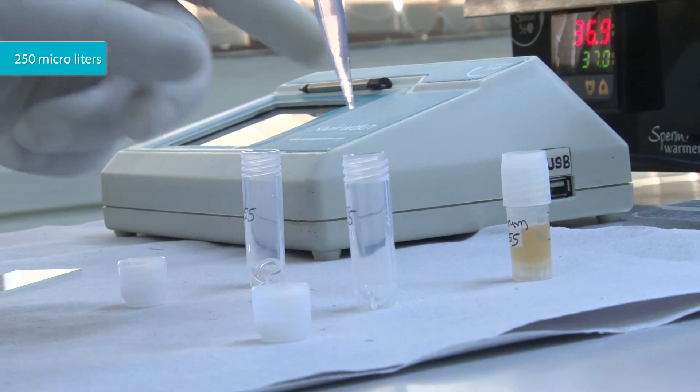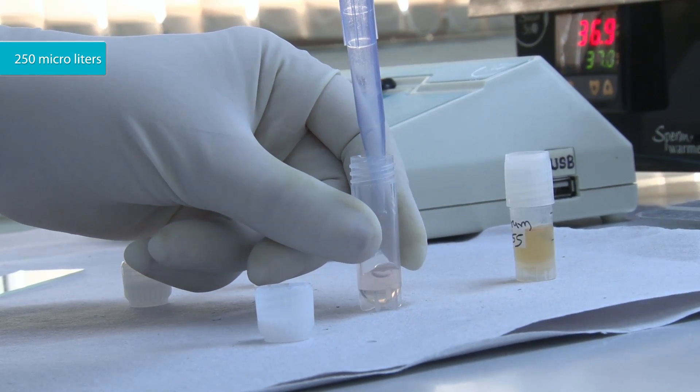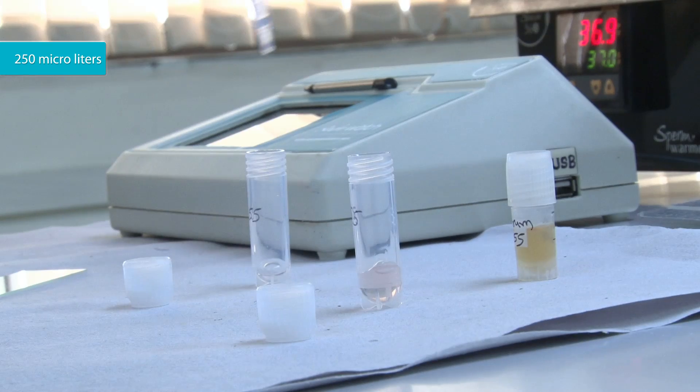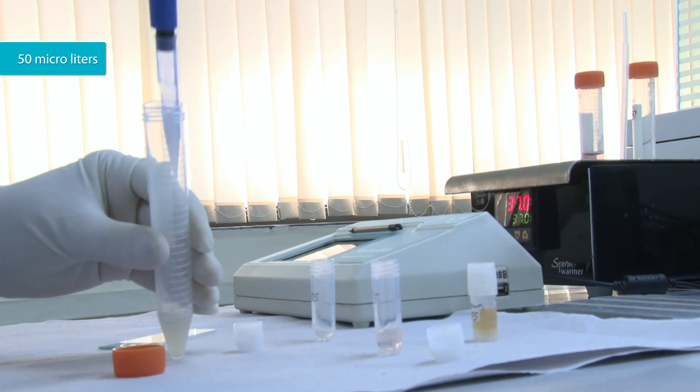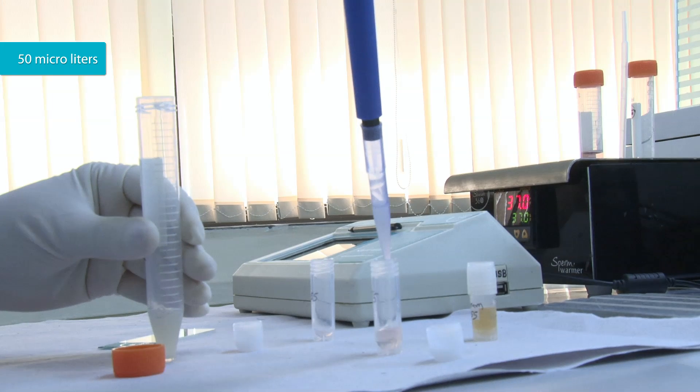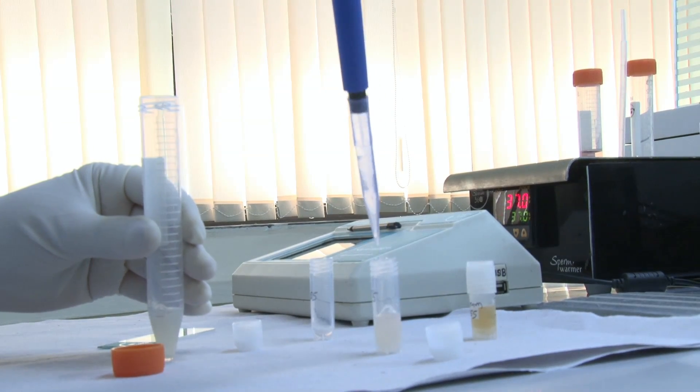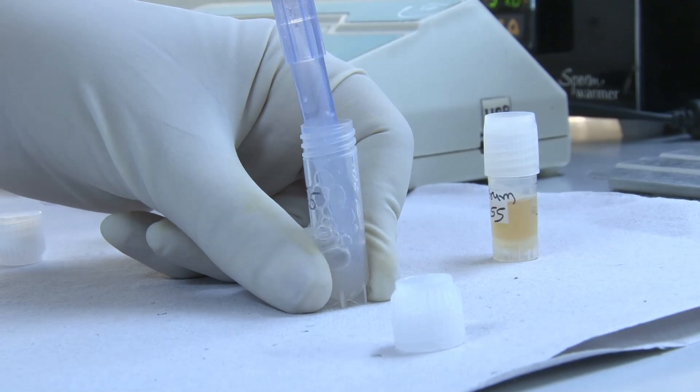Put 250 microliters of diluted serum in the tube. Add 50 microliters of donor semen to this tube. Mix well.